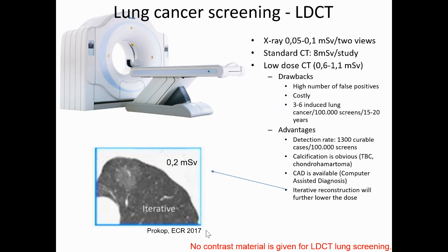In 2017, iterative reconstruction was shown at the European Congress of Radiology in Vienna, and they were showing us CT images which were generated with the same dose as an X-ray study would have been done with.